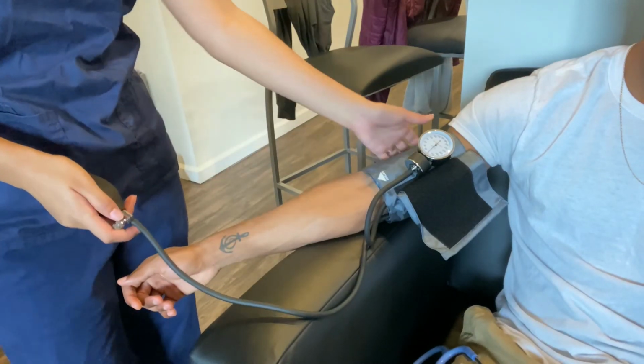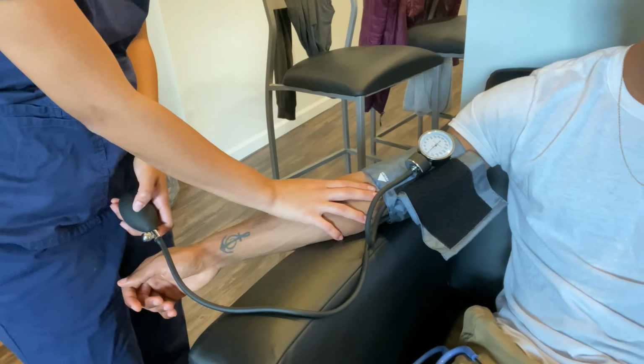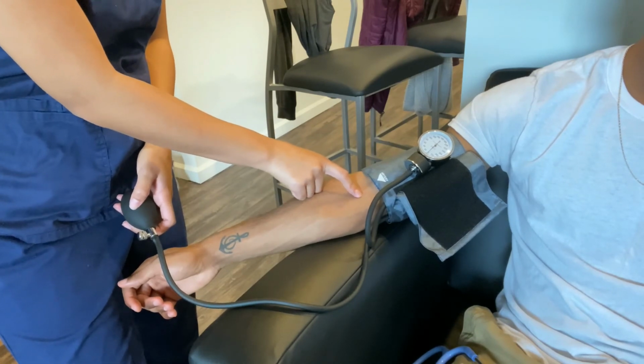When taking someone's blood pressure, you have a blood pressure cuff and you have a pump right here. The first thing you want to do is feel that brachial pulse so you know where to place the blood pressure cuff. Right here, there's an arrow pointing with the word artery on it so that you know where that pulse is.